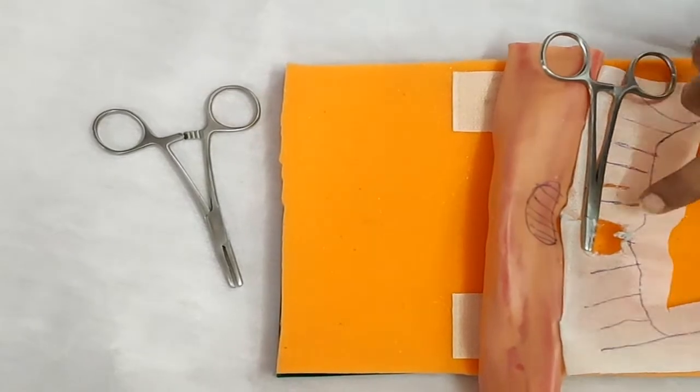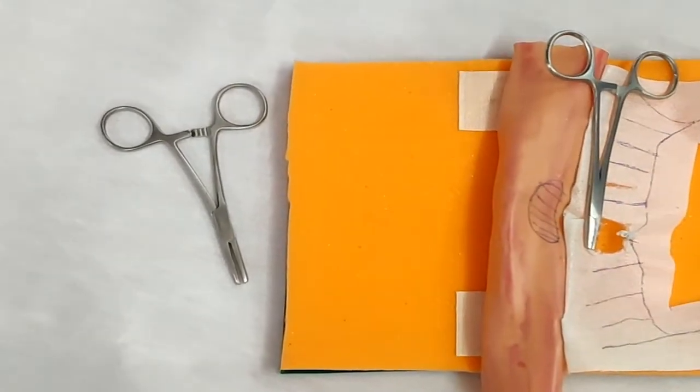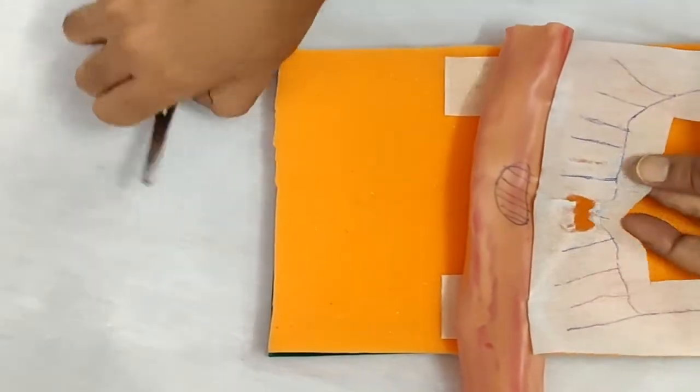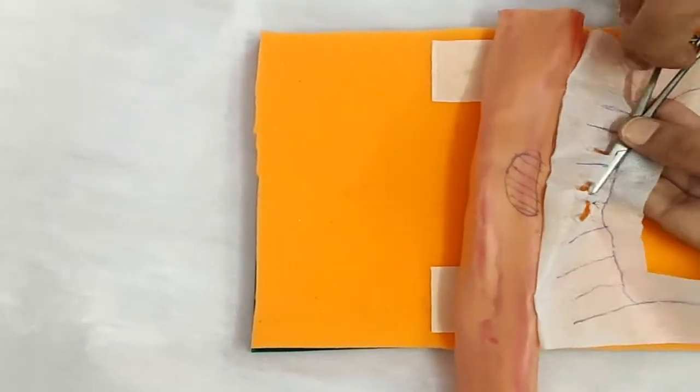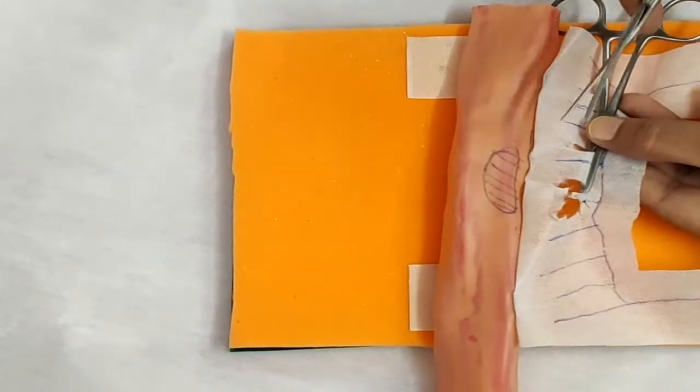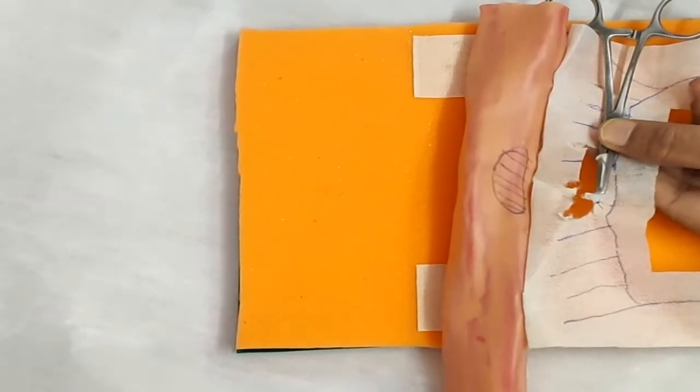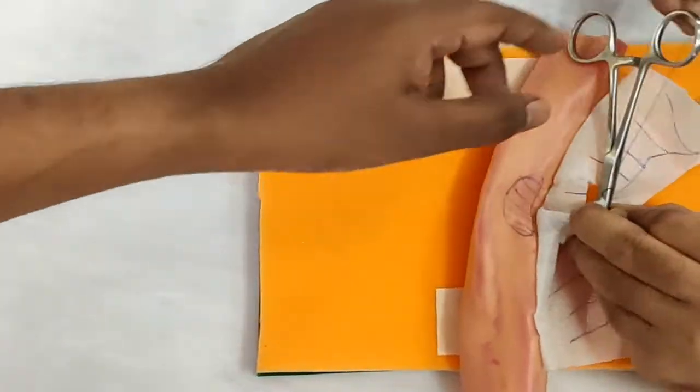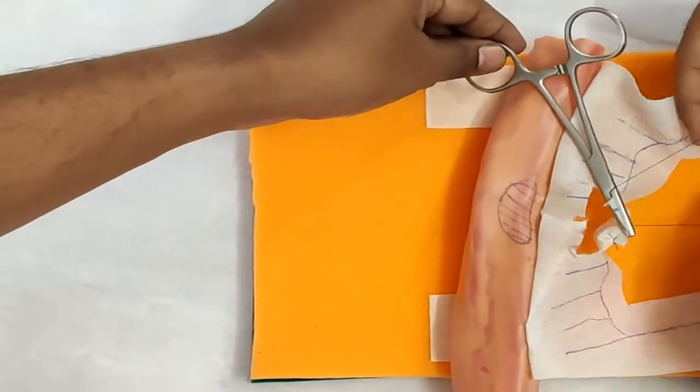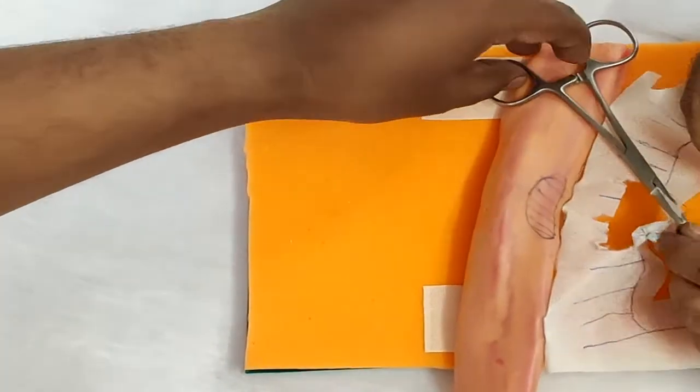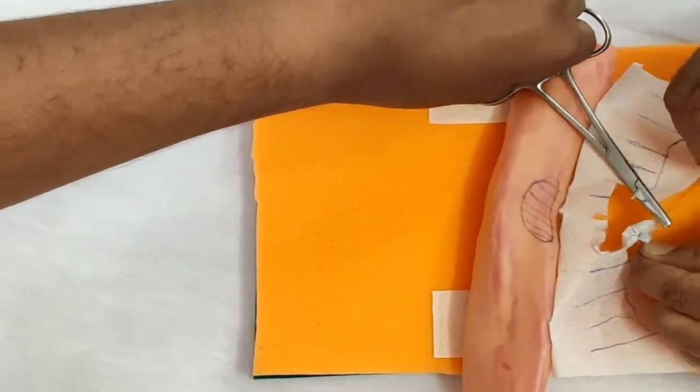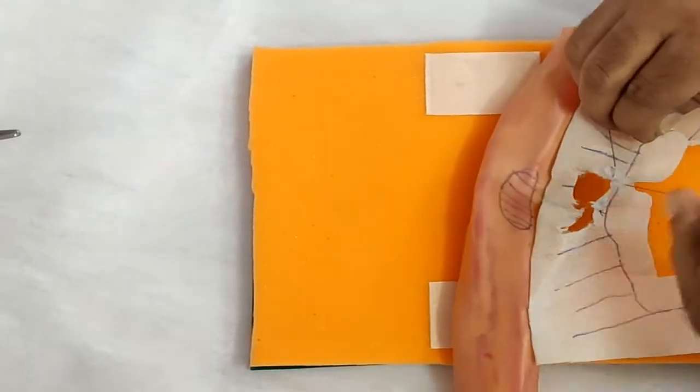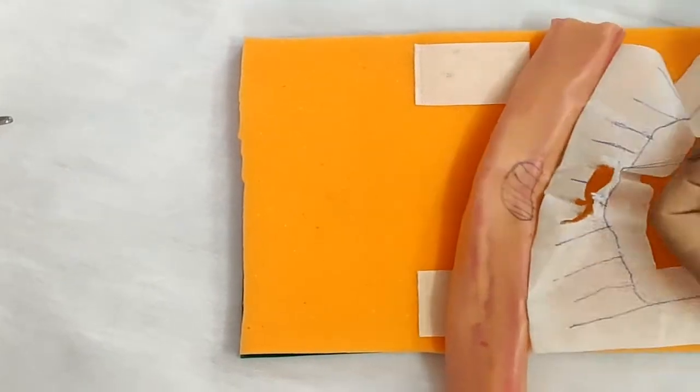Similarly, we will repeat this for all the procedures. We can see the structure shrinking and adequate blood vessels are ligated.